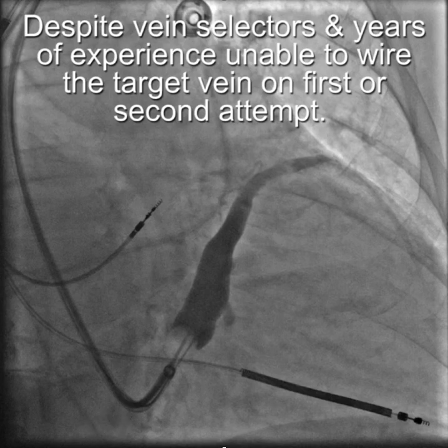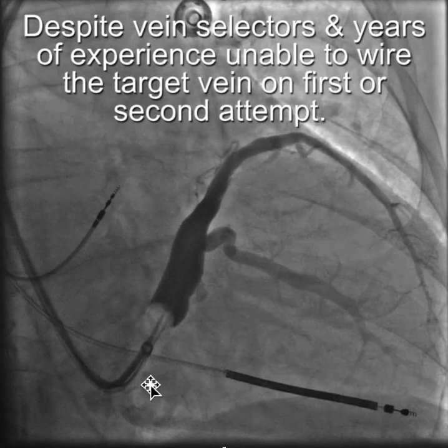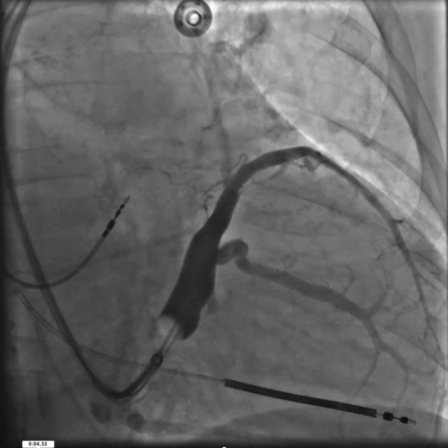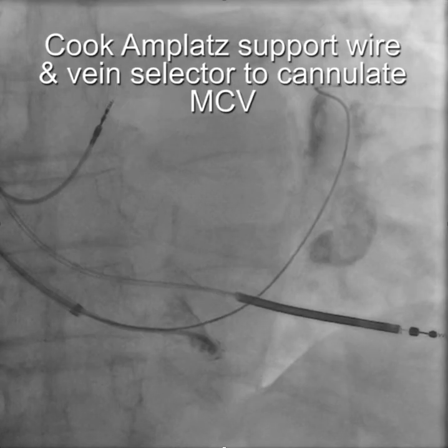This is a case from last week that emphasizes the importance of the microcatheter for passing a wire through the collaterals. In this particular case, it was an antidromic snare case, and this is the target vein. Despite years of experience, and on a second try, I could not get into that target vein. It looked easy, but it wasn't.